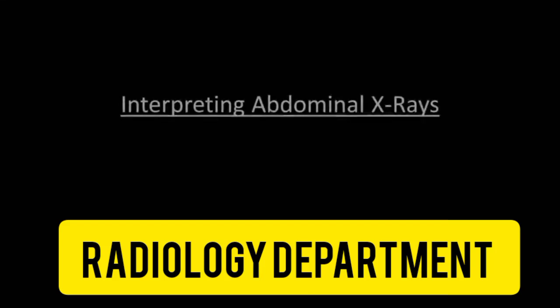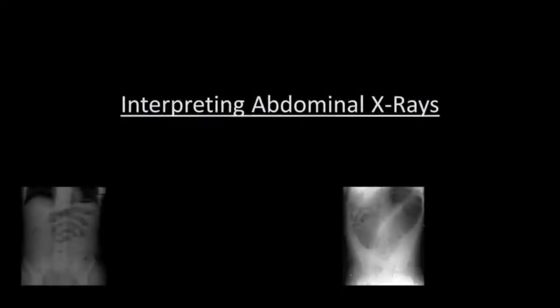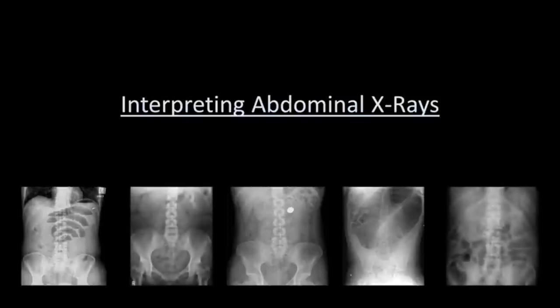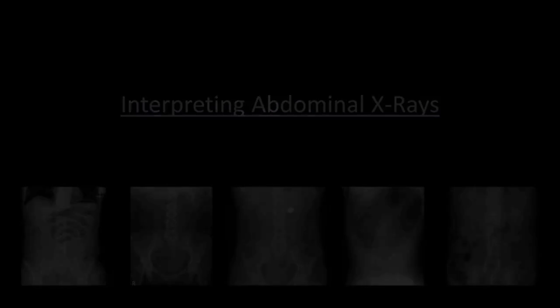This is going to be a very short video. When it comes to abdominal x-rays, there are only a few things that you need to understand at this point. And this video is designed specifically so that you can learn a basic approach and be comfortable with most abdominal x-rays that you're going to see.